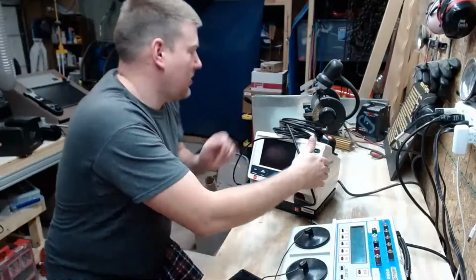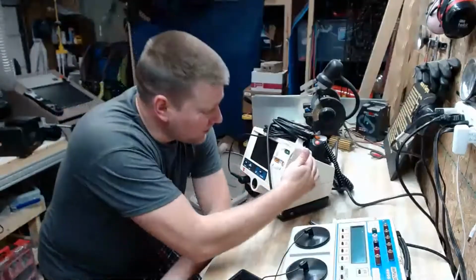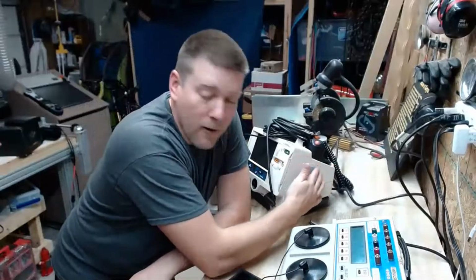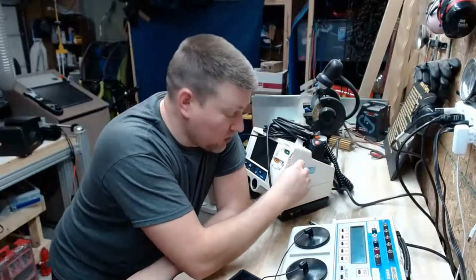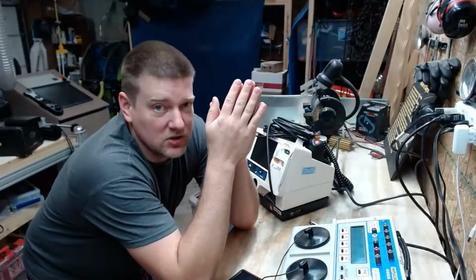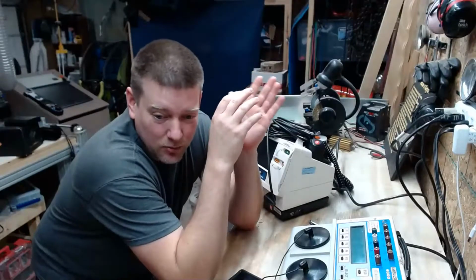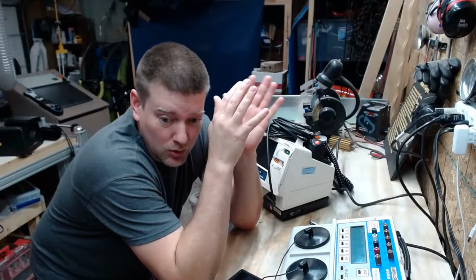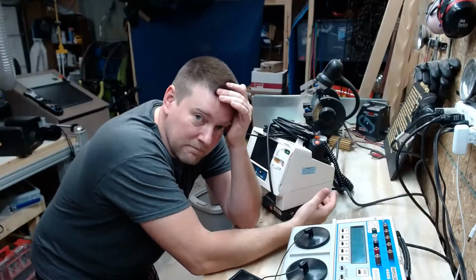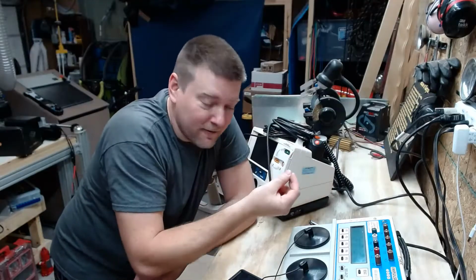Make sure, because often they have a speaker, although these ones don't. The Zolls have a speaker on the side, and I would put my new PM sticker over the speaker, and I would rip the old one off. What that does is, when you're in like an ICU or something and you're checking out these defibs, you don't want to irritate the hell out of everybody with that loud sound. So you put the sticker or a piece of tape over the speaker, and I always put the new PM sticker over there so I would never forget it.